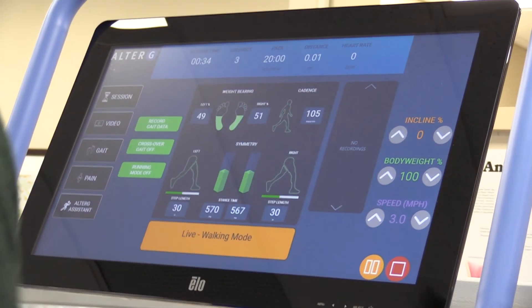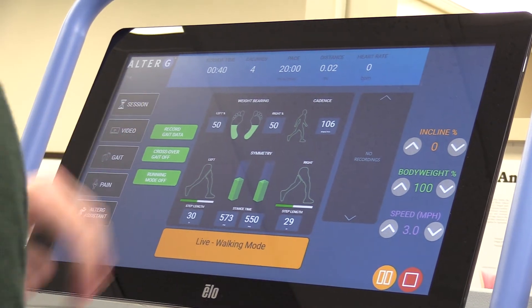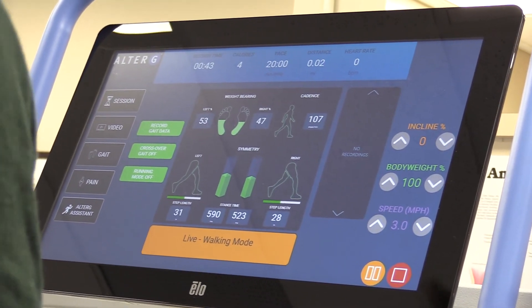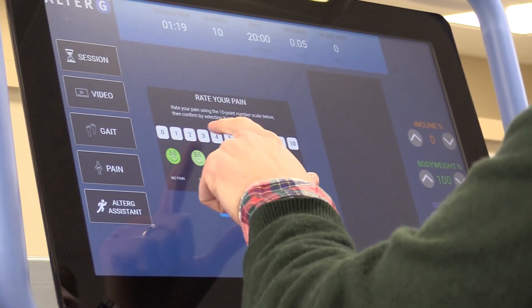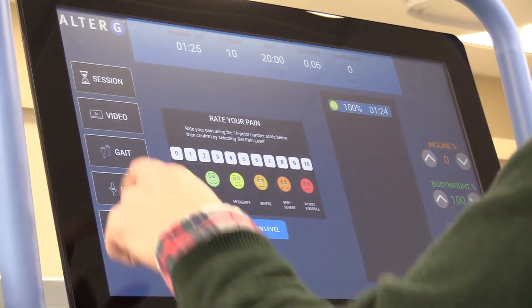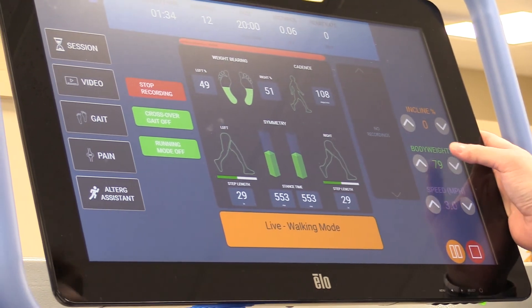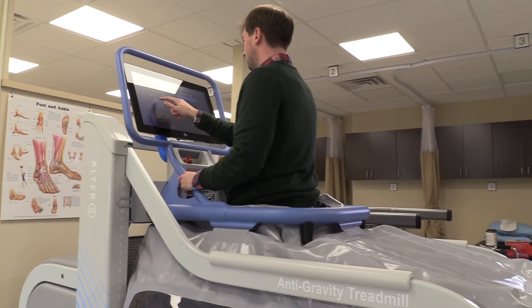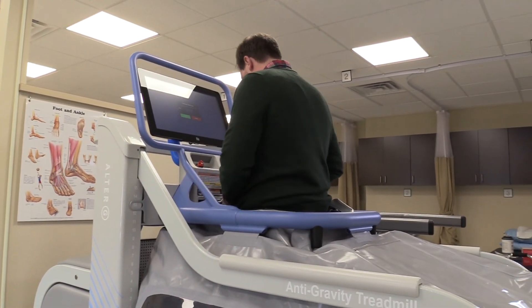We have gait analysis software on the screen as well, so we can look at the person's foot as it hits the ground. As a clinician, we want to isolate what might be causing issues or identify predictive factors. There are cameras inside, and the screen shows how much weight is being put on each foot, what part of the foot is hitting first, and how long the strides are. We can save that data and send it to the patient's doctor, which is really helpful.